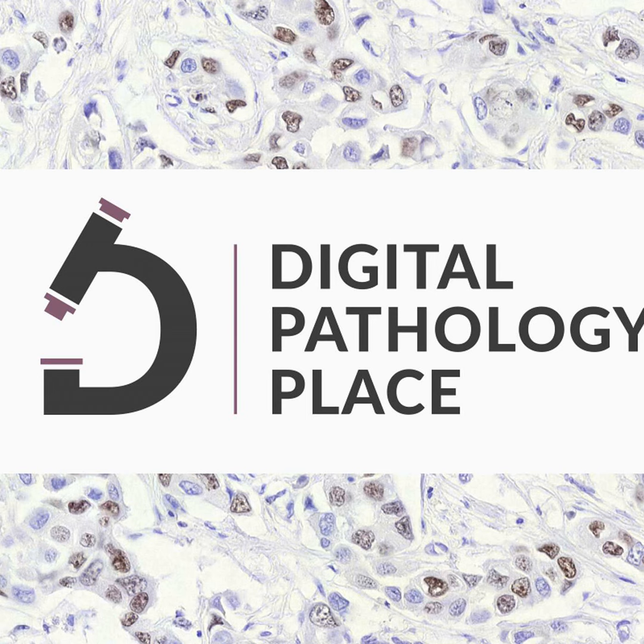Now, if that's not been done... Question. Let's say there is a Ki-67 approved algorithm on the market and you want to use Ki-67 quantification as your endpoint. Then it would be recommended to use this very algorithm and not develop your own from scratch, or not necessarily. I would say it's the easiest way, with less risk.